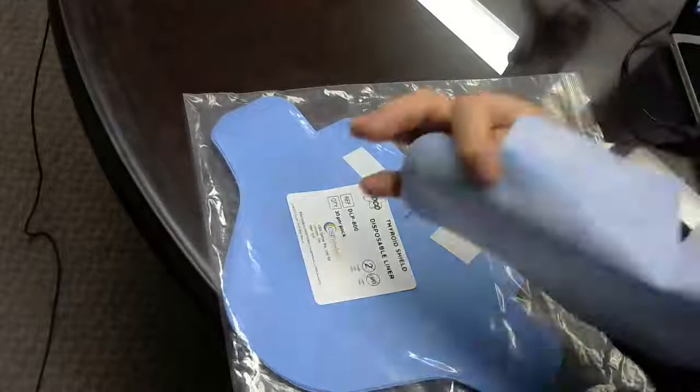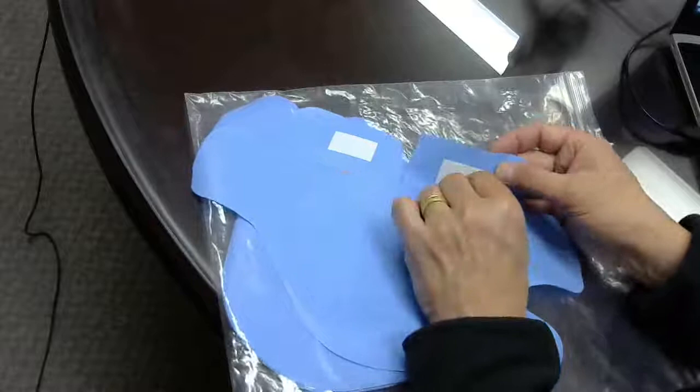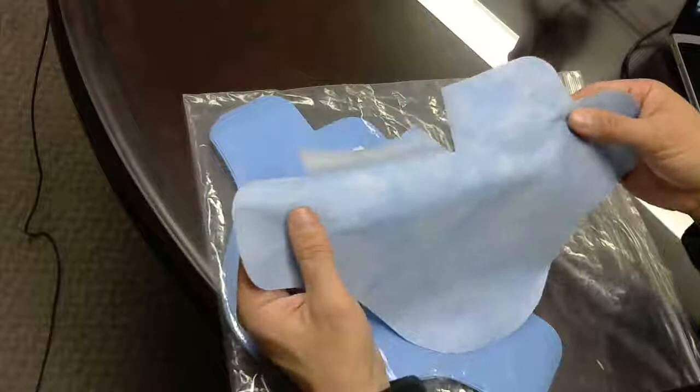This is a nice soft material that goes on the inside of your thyroid shield. Basically, you put the thyroid shield here — these are peel-back stickies, so it'll stick to the thyroid shield and give you a nice comfortable liner.